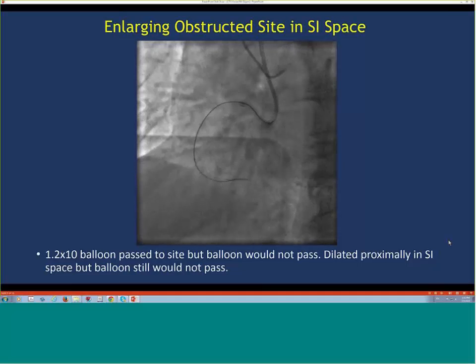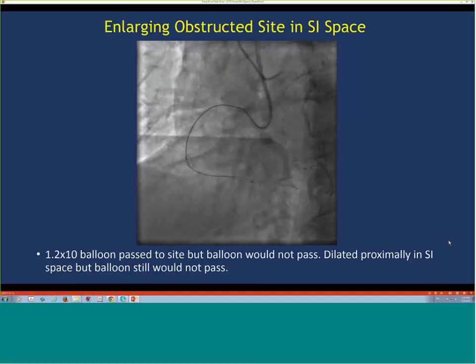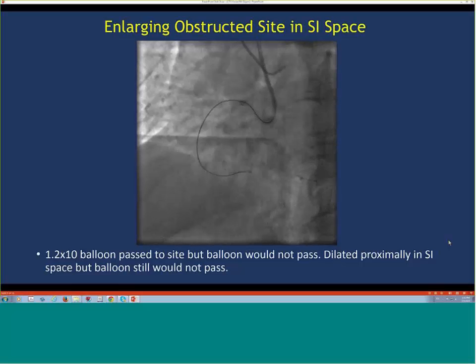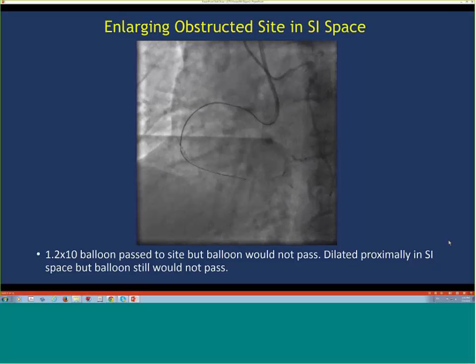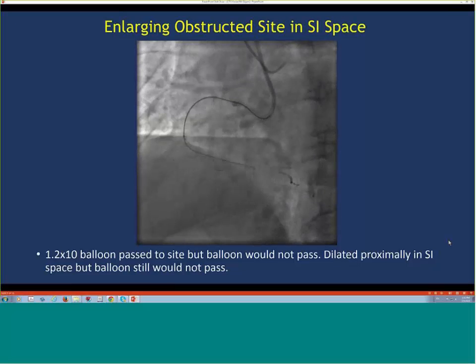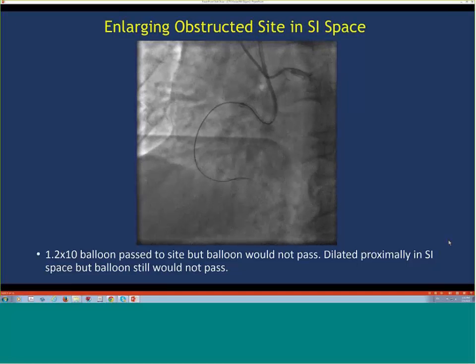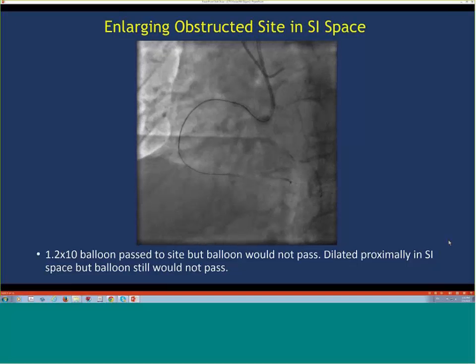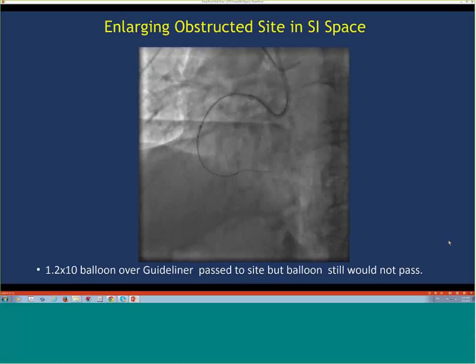So that's an interesting situation. It's a balloon uncrossable lesion essentially, but it's before you cross distally. So the challenge is you don't want to move the loop, the knuckle, too much. Yeah. But you still have to get through somehow. And you're subintimal, right? So you're not in true lumen. So even though you're subintimal, you still can't get the balloon through. Right, that's right. And is that what you would have done next, put the GuideLiner in? Yeah, so sometimes, I mean, you can try the Corsair there or the Turnpike now.